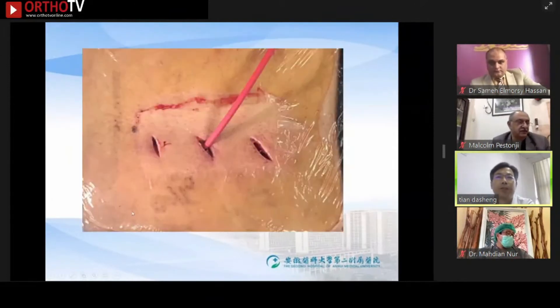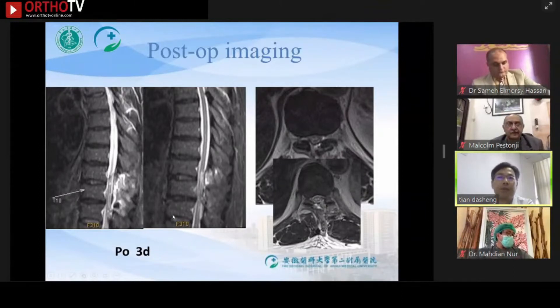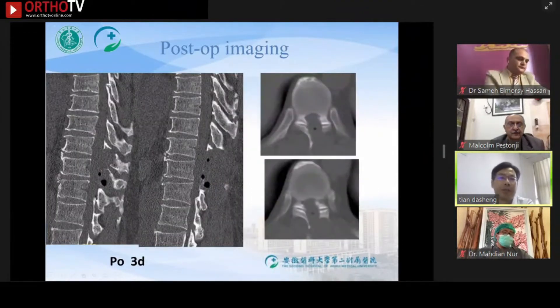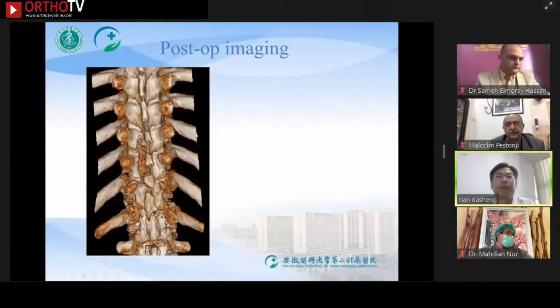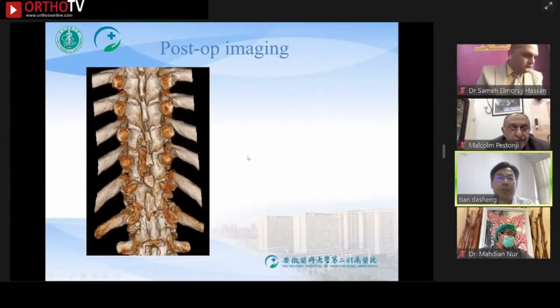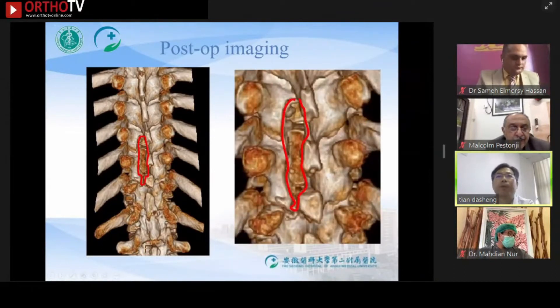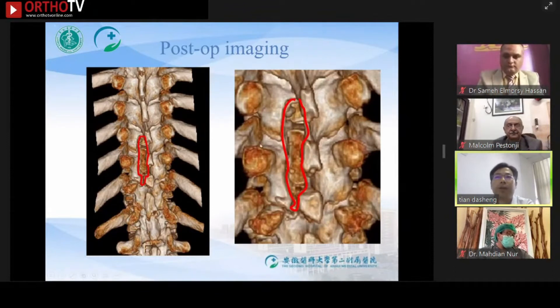This is the skin incision. This is the MRI, and this is the intraoperative view. We can see that the ossification has been removed. This is the three-dimensional CT scan after the ossification removal. We protected the facet joint as much as possible.